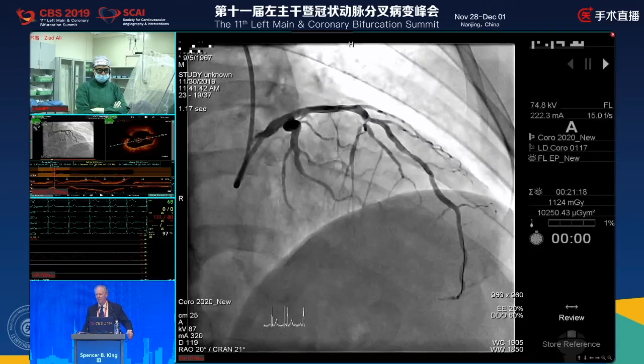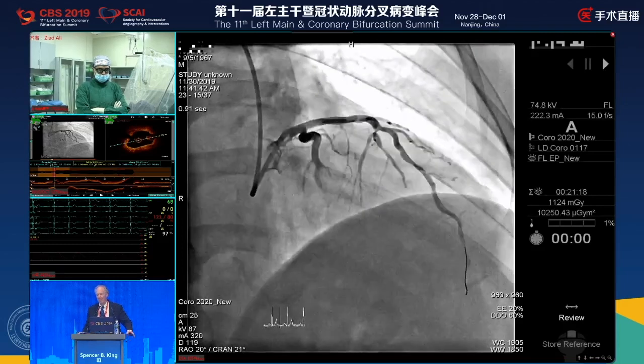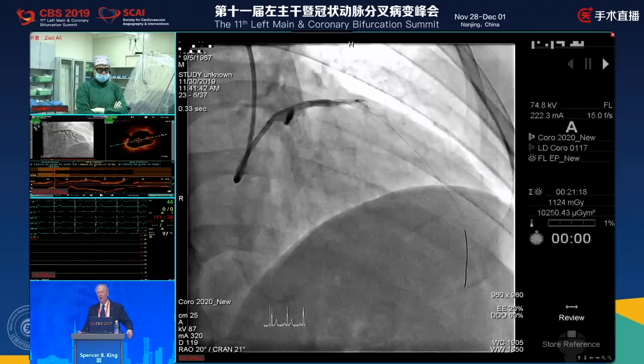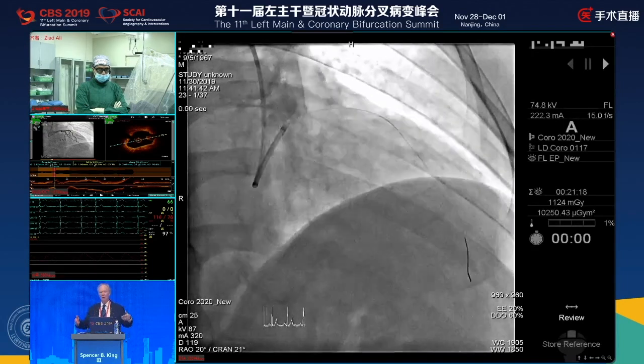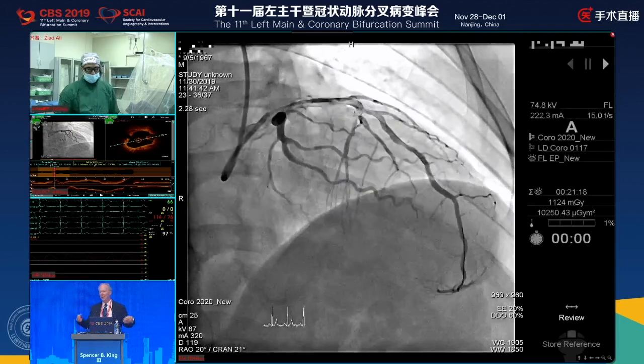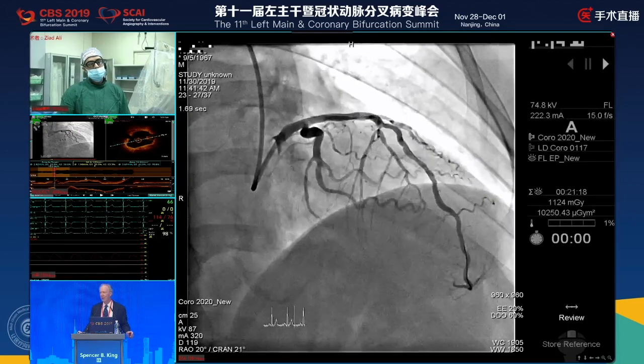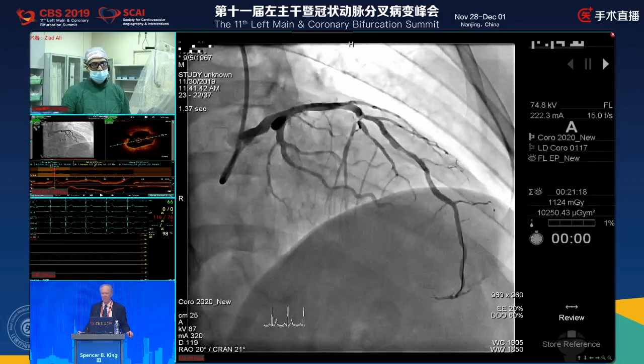All I'm saying is I think a septal perforator can cause pain. Eight hours of pain without a change once you restore the thing is probably strong evidence against this being the etiology. But I think we tried to take a thoughtful approach to this, Spencer, by using physiology and proving that the main vessels were non-ischemic.